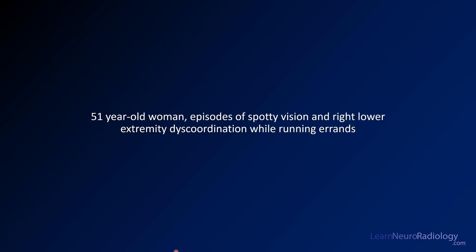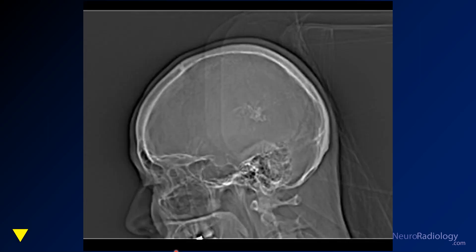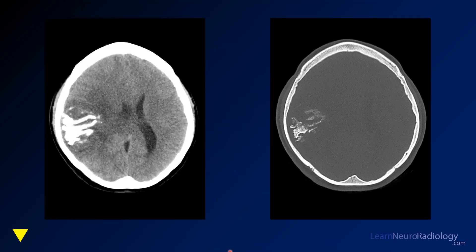We'll start with a case of a 41-year-old with vision changes and lower extremity discoordination. This is a scout image from a CT. You can see there's something in the center here where it should not be, so you want to be attuned to that on the actual CT images.